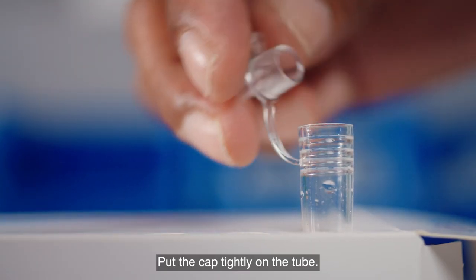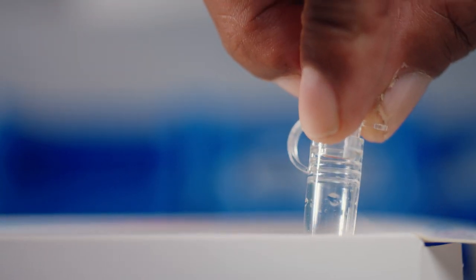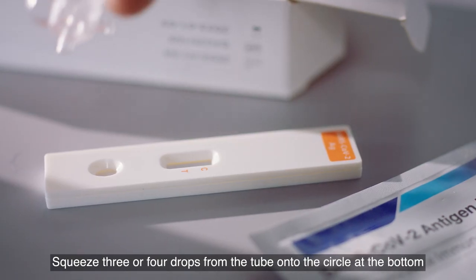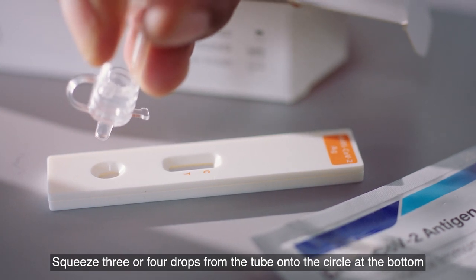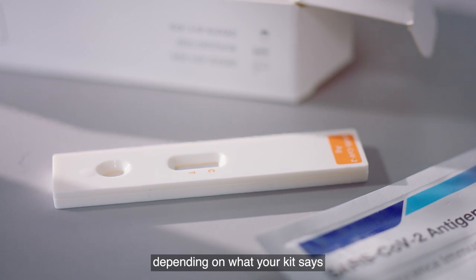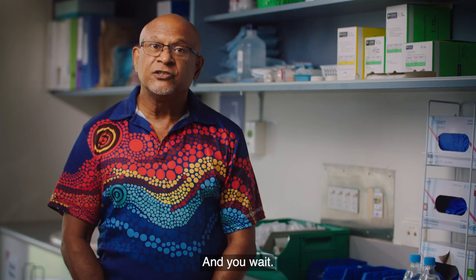Put the cap tightly on the tube. Get the strip that will show you if you have COVID-19. Squeeze three or four drops from the tube onto the circle at the bottom, and set your timer for 10, 15, or 20 minutes, depending on what your kit says. And you wait.